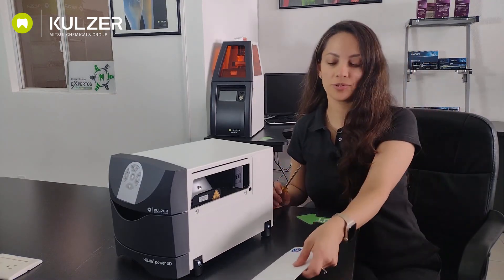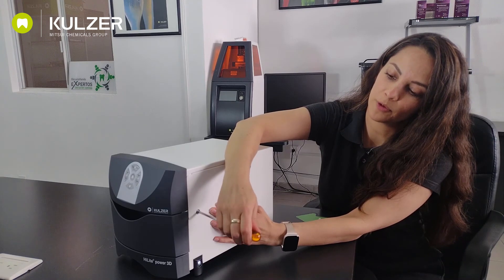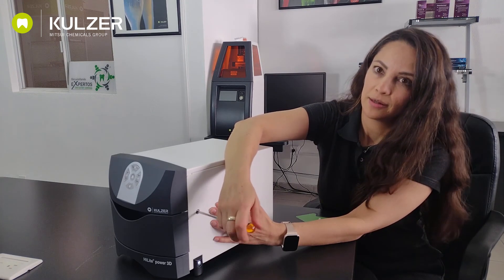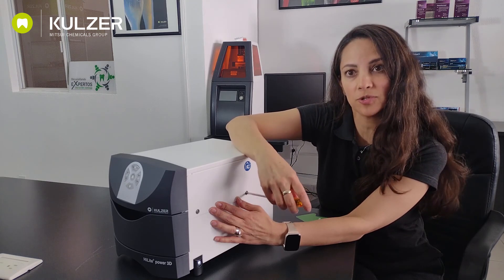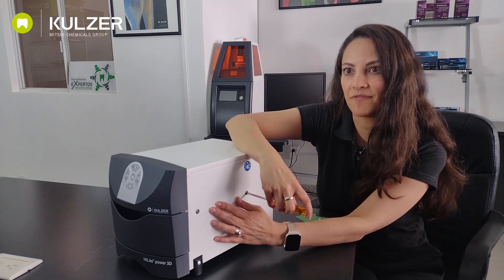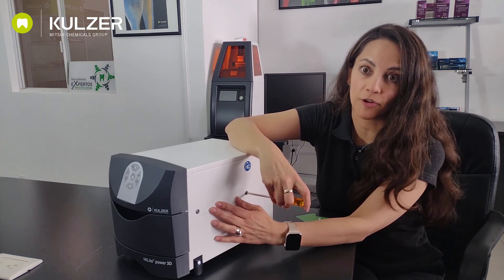Now we are going to close the device. We only have to put it here and screw back with a Phillips screwdriver. The Highlight Power units generate a lot of energy. Therefore, they also generate heat. In long exposure times or continued use of high light power, the parts sometimes get very hot. However, the heat does not lead to any disadvantage or any reduction of the performance of the product.